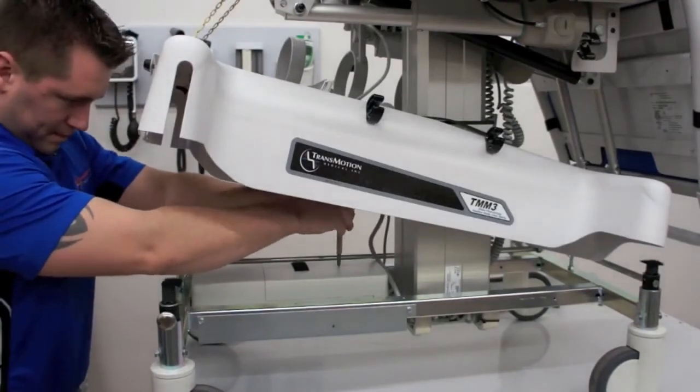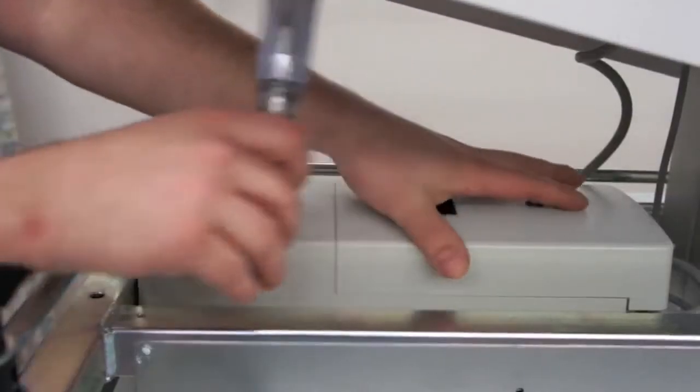Use your flat head screwdriver and turn to the unlock position, then remove the control box cover.